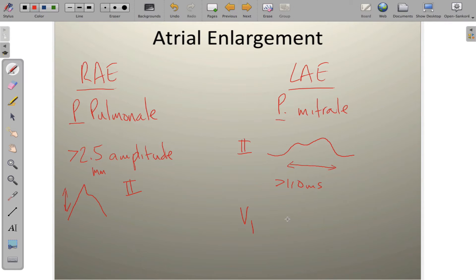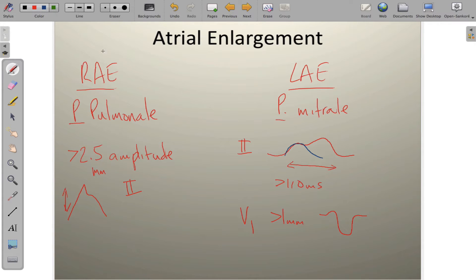In V1, the P-wave terminal deflection is greater than 1 millimeter deep. This early component of the P-wave represents right atrial depolarization, and the later component represents left atrial depolarization. The EKG can't separate two simultaneous electrical events, so it sums them together. The first component represents the right atrium depolarizing; because the left atrium is enlarged, there's a delay in depolarization. Right atrium goes first, left atrium follows but is delayed.